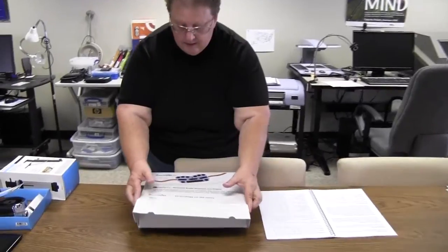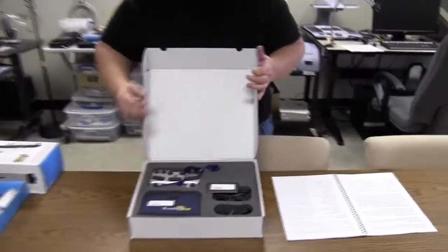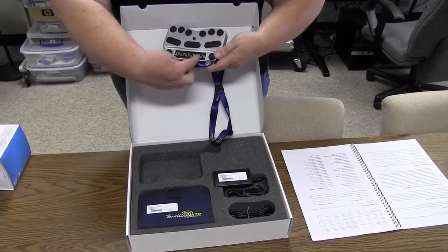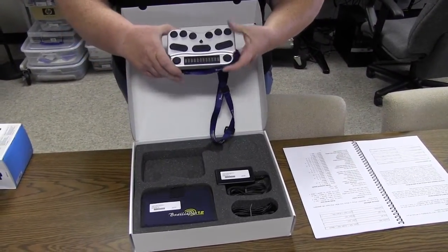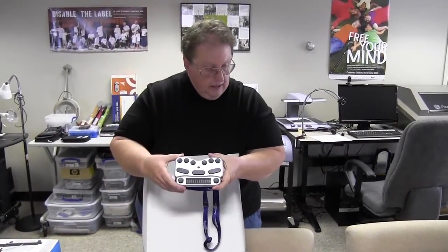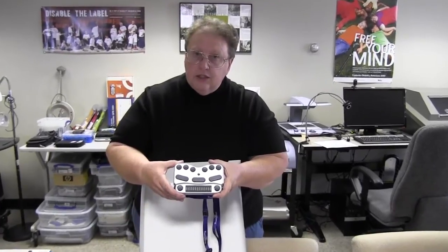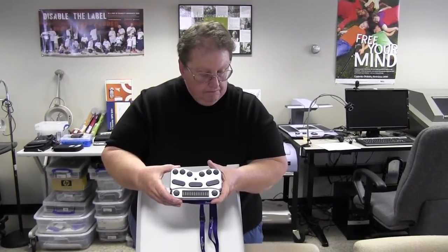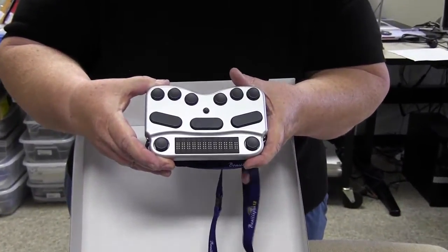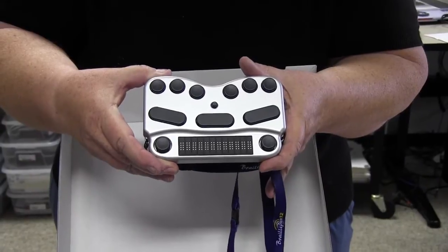I'd like to show you a new device that we have in. It is called the Braille Pen 12. There's another device that's similar to this, but it doesn't have these 12 cells. This is essentially a Braille keyboard for an iPod Touch, an iPhone, any of the iPhone 3s through 4, the iPad 2, the iPad 3.